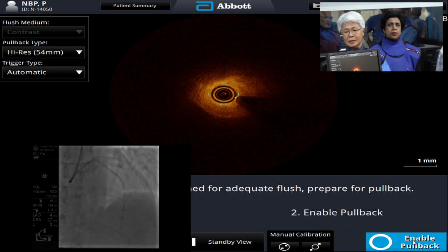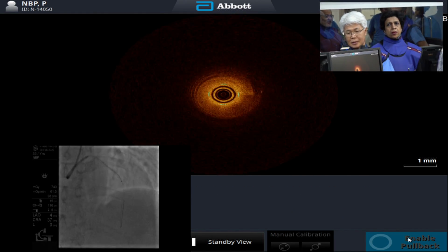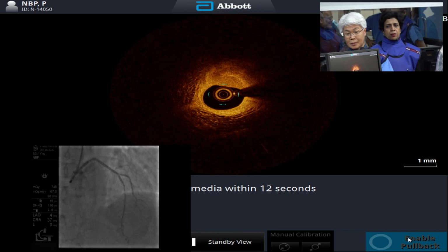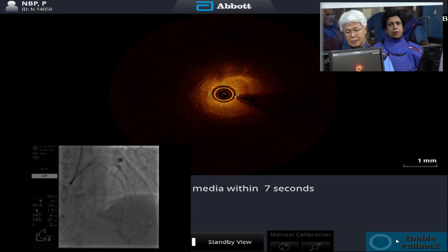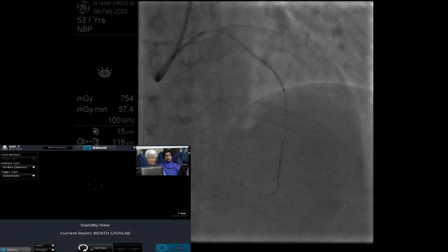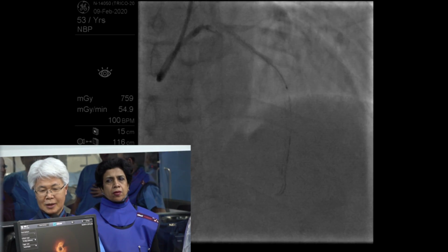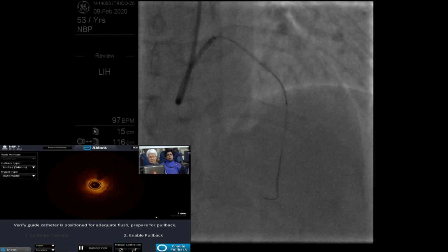We put 2 stents and then we did them at a minimal pressure of 10 atmospheres, and then we pulled back and did it with the maximum, we went to 20 atmospheres. Is there any chance of proximal end endothelial damage that can give inflow stenosis in the future? We should not be scared of that. If the landing zone is lipidic, there is a risk of stenosis.